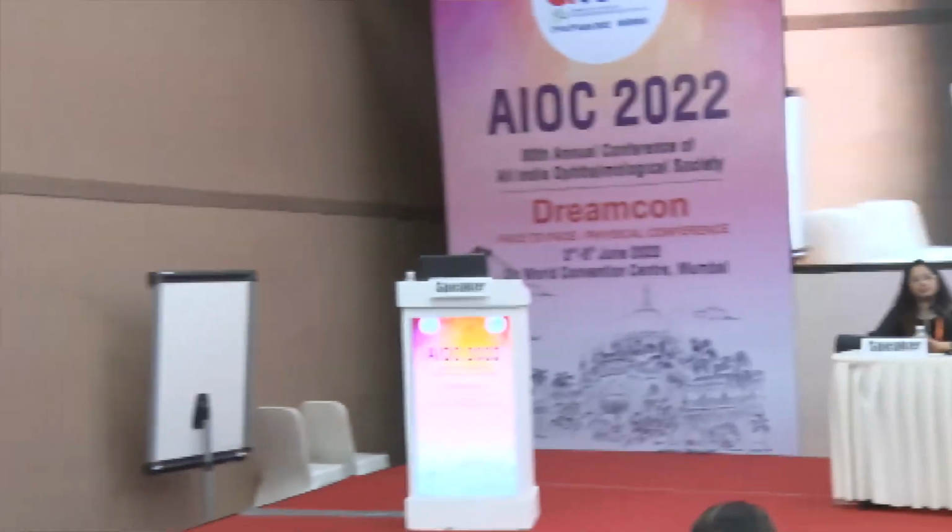OCT shows only the retinal ganglion cell loss, no other changes. Sir, the OCT, and there is a paracentral scotoma. Would you treat? Yes, of course. If I have a GCC loss which is in the pattern of glaucoma loss, on the macular scan, and a central focal defect, correct.